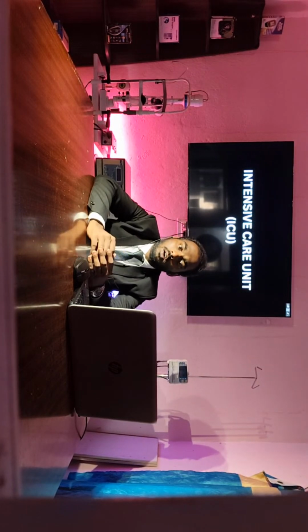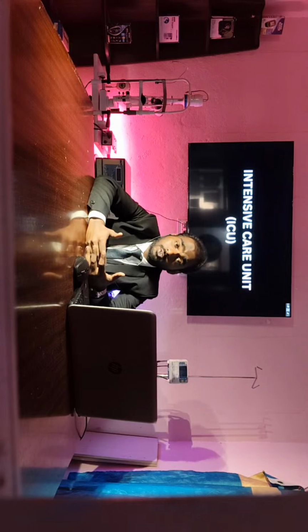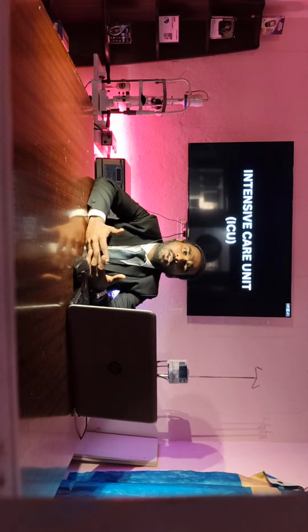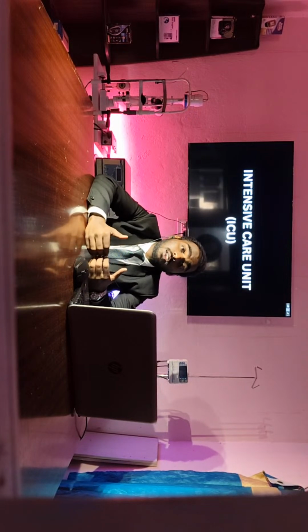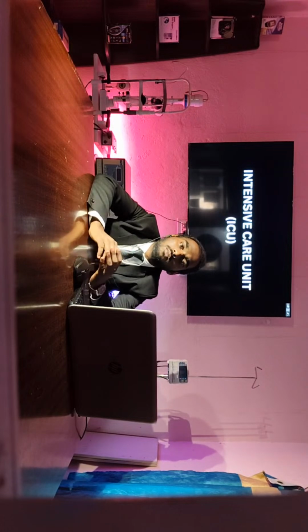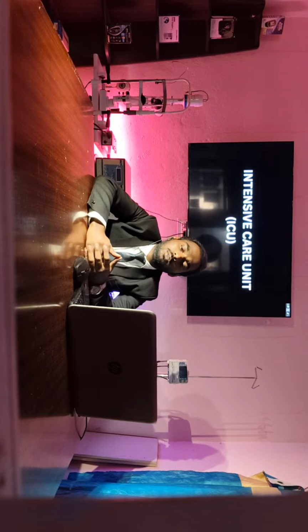For example, a suction pump. Then how can I treat the patient with the help of drug delivery systems? With the help of an infusion pump and a syringe pump, they can administer the drug into the patient's body. We also need to note whether the drug is accepted by the patient's body or not. For that, they need to monitor the vital signs of the patient.